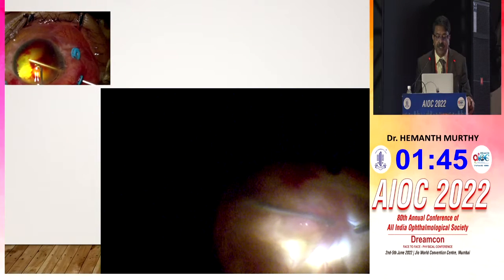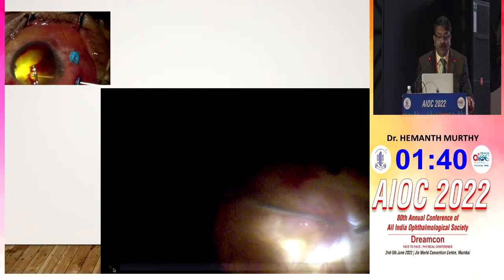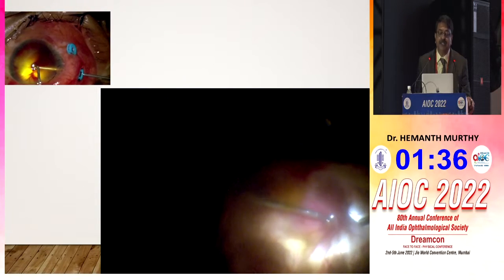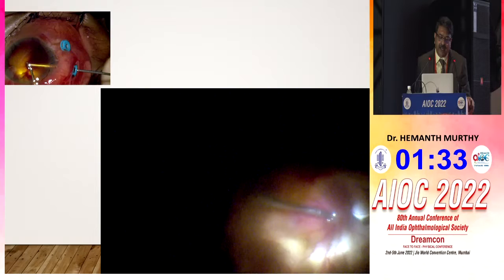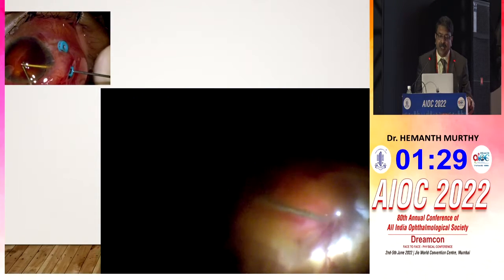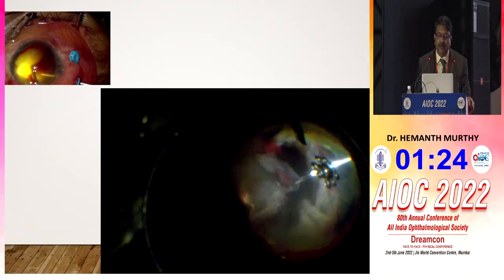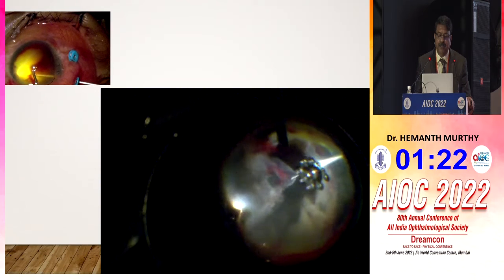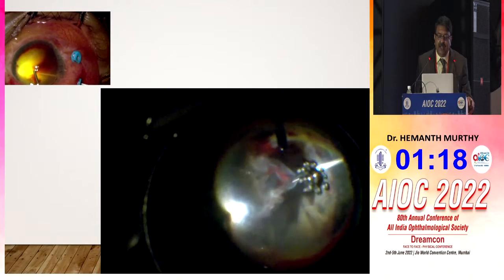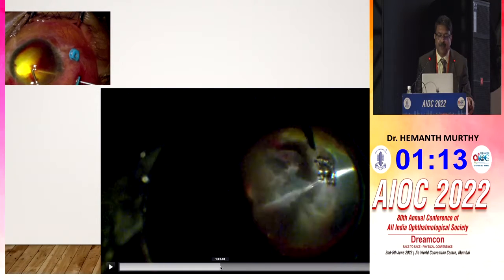Another situation is traumatic retinal detachments, wherein you could use PFCL as a short-term tamponade. In this patient who came with a massive tear and detachment with subretinal hemorrhage, initially, after clearing the hemorrhage, I put in PFCL, did bimanual dissection of all the membranes, both in front and behind the retina. And I left the PFCL in this eye.